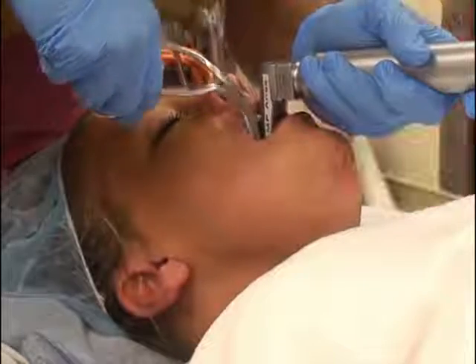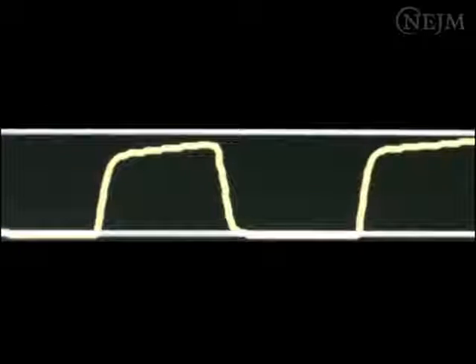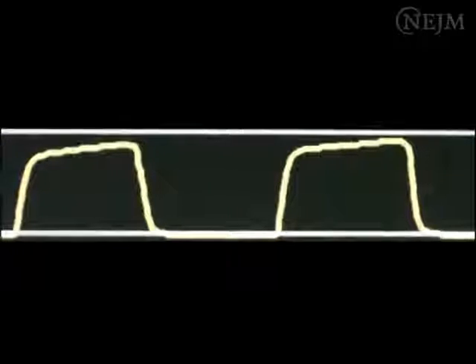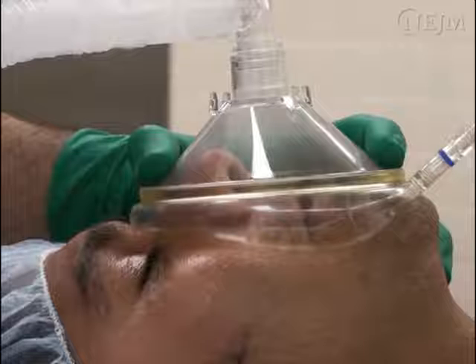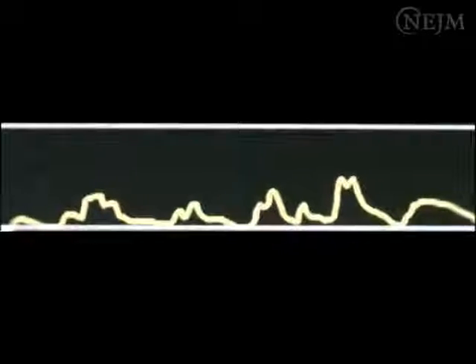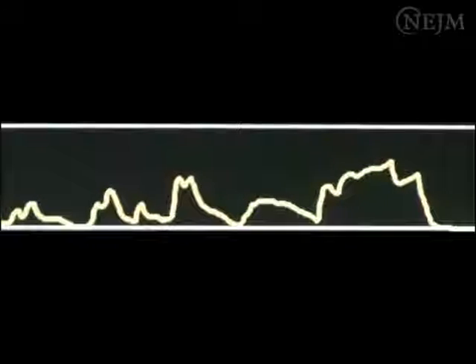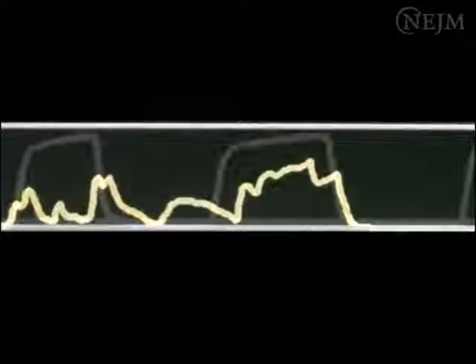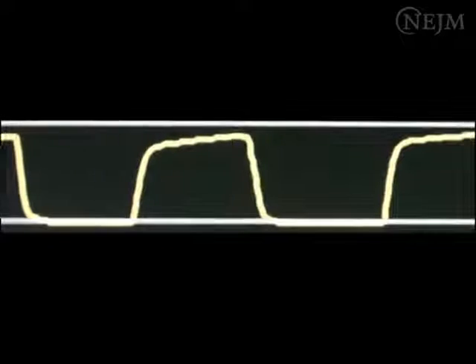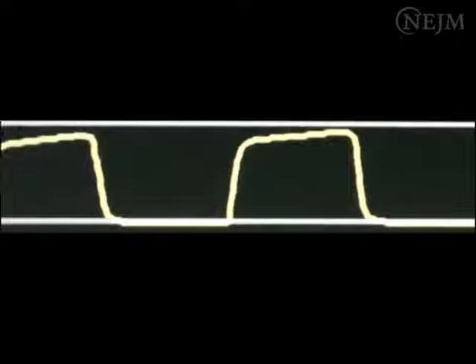In patients undergoing endotracheal intubation, capnography helps to show that the trachea, and not the esophagus, has been successfully intubated. However, if the stomach is insufflated with air that contains carbon dioxide, or the patient has recently swallowed a carbonated beverage, the capnogram might transiently show the presence of carbon dioxide even if the endotracheal tube has been erroneously placed in the esophagus. A series of successive, steady, normal capnographic waveforms must be seen to rule out esophageal intubation.